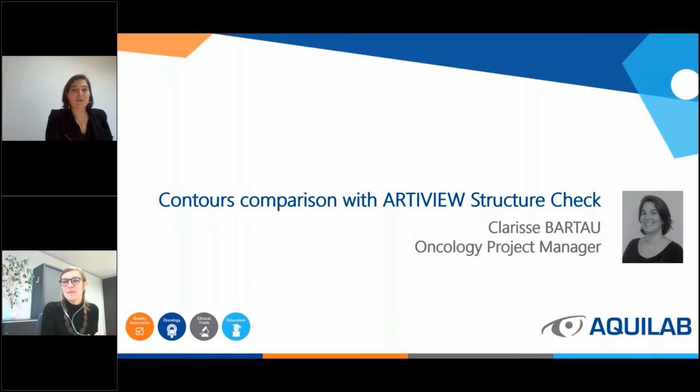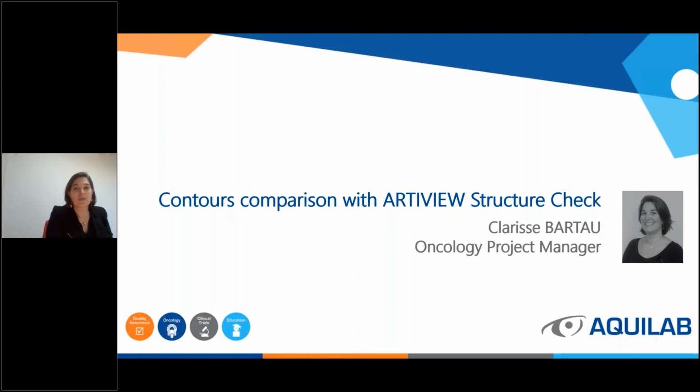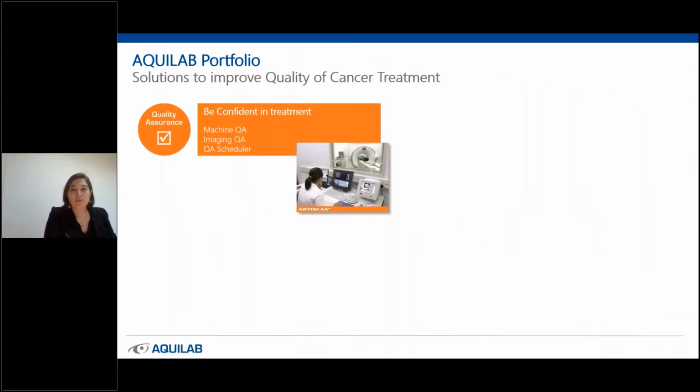So first of all, I would like to thank you and to welcome you in this webinar dedicated to contours comparison with our solution ARTIVIEW Structure Check. Before really beginning, I will present you AQUILAB. AQUILAB is a French company which develops and markets advanced software solutions to improve quality in cancer treatments.